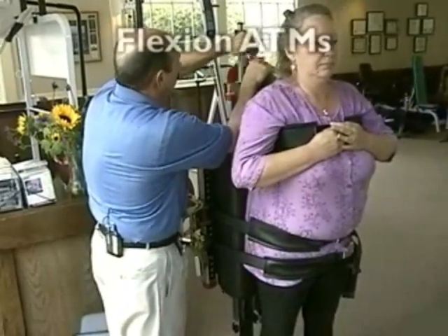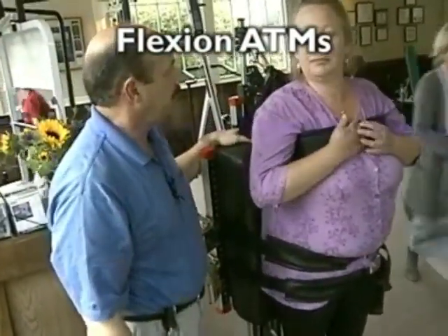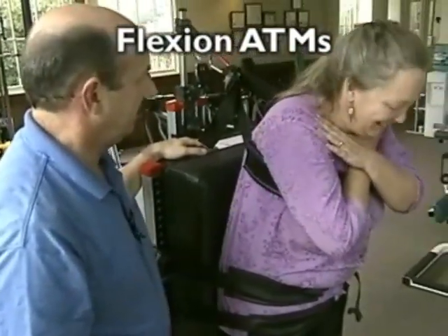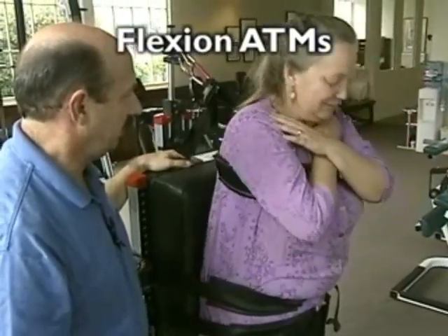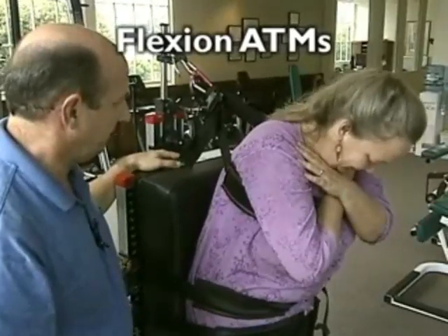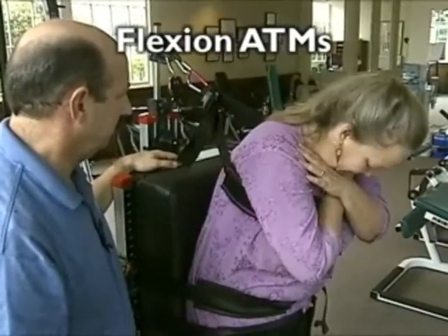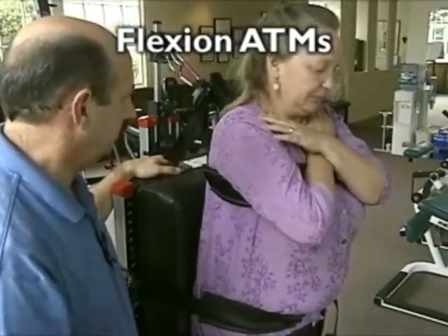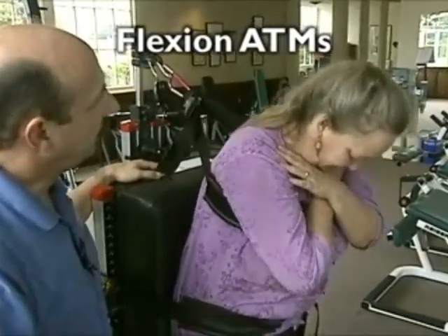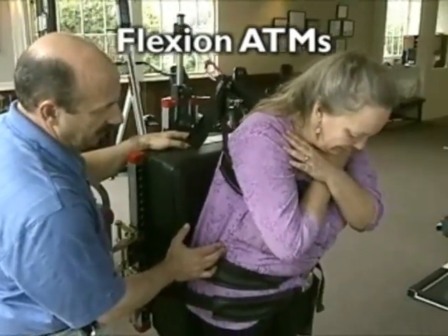This patient's pelvis was repositioned with two restraining belts around her pelvis on the ATM1, the previous model of the ATM2. Her pain-free position was found to be a combination of posterior pelvic tilt combined with horizontal pelvic rotation towards her painful side. After a successful pre-evaluation, she performed repetitions of lumbar flexion ATMs, now pain-free because of the passive holding. The movements are in the neutral range and are not close to the previously painful range.